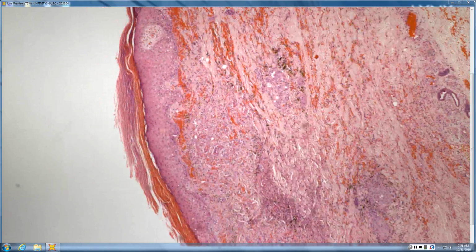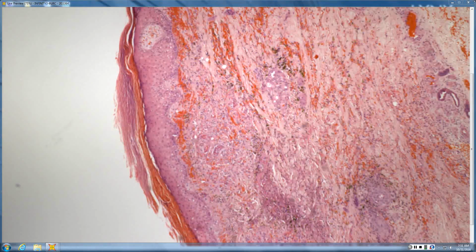Looks like I have some hemosiderin deposition. A lot of hemosiderin deposition. And tell me about the vessels. Are they solitary or are they in cannonballs? Cannonball. So you have cannonball angioplasia and hemosiderosis adjacent to an ulcer. So you think of stasis dermatitis. Stasis! So you're describing all of these changes of stasis, which is the cannonball angioplasia and hemosiderosis. So you have changes of stasis, and next to that an ulcer. It could be an infectious ulcer in someone with stasis, or it could simply be a stasis ulcer.